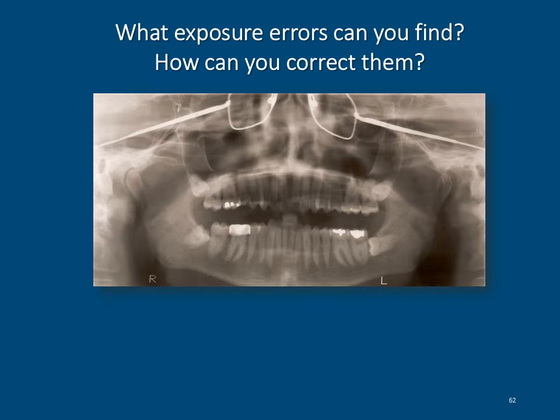Let's take a moment to test ourselves to see if we can identify the exposure errors and the corrections for them.